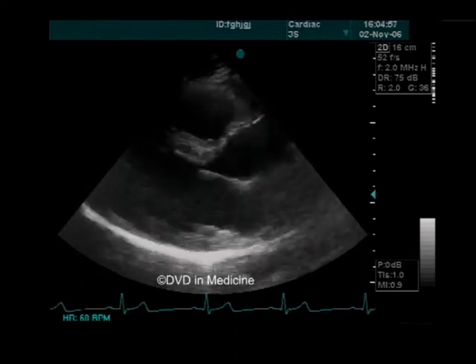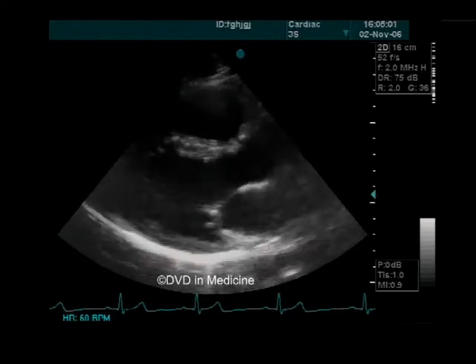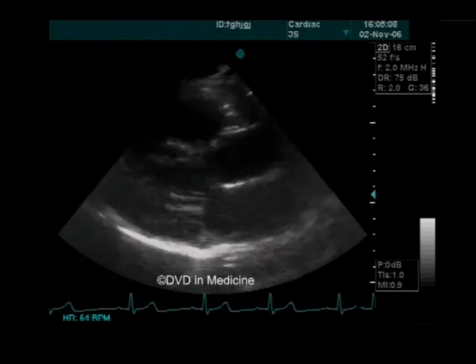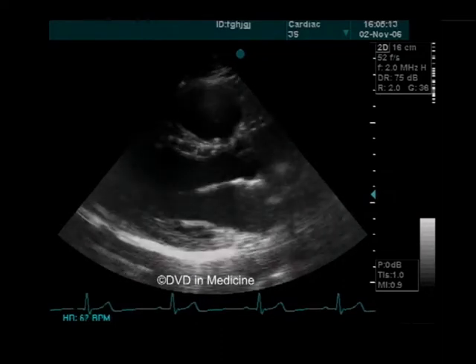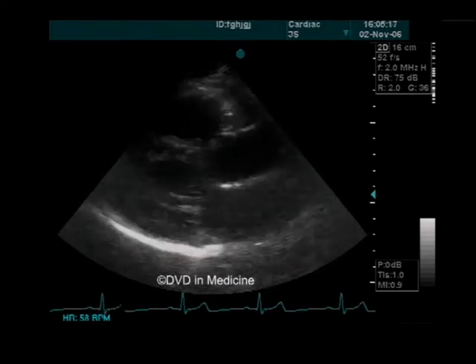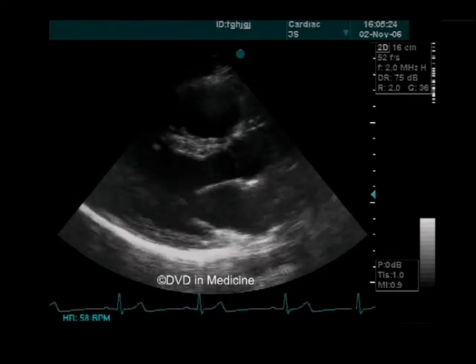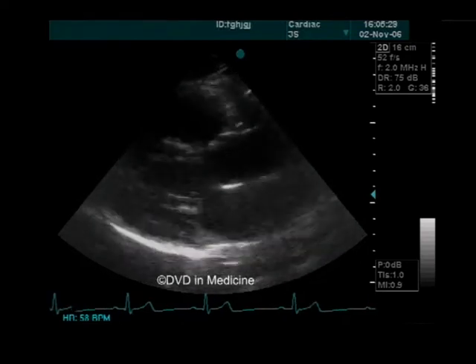4. To assess left ventricular systolic function. 5. To determine the amplitude of motion and thickness of the interventricular septum and posterior left ventricular wall. 6. To see membranous defects of the interventricular septum. 7. To confirm mitral aortic fibrous continuance. This is important in the diagnosis of some congenital heart diseases. 8. To diagnose structural changes and dysfunctions of the mitral valve and its supporting structures, cord, papillary muscles.